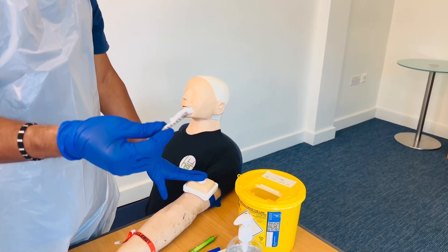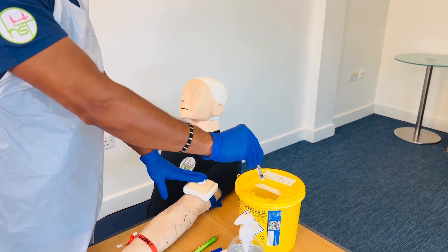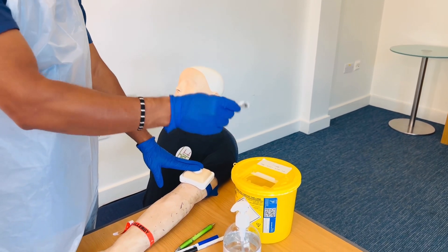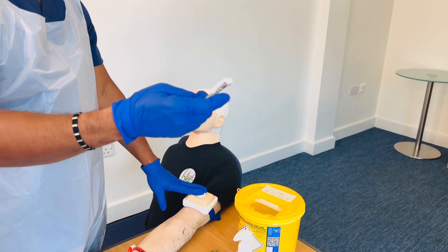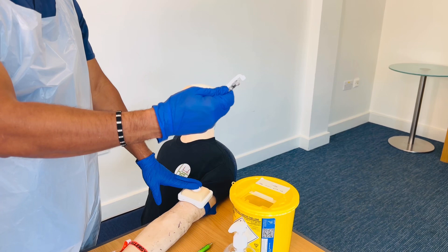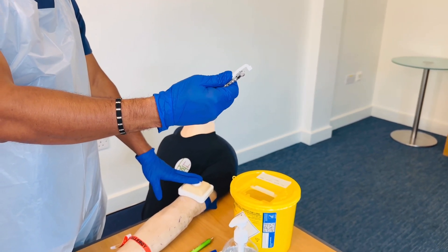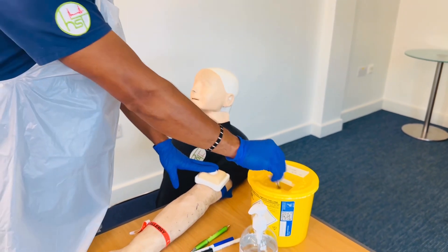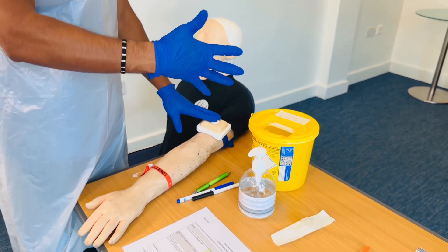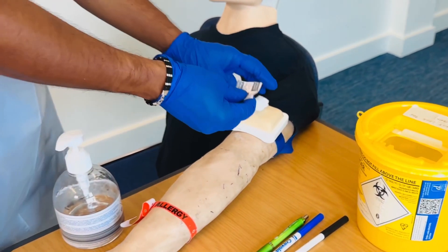What do you do with the syringe? The easy method is to throw it directly into the sharp bin without locking the safety cap. If you do want to lock it, push the white part with your thumb all the way until it locks, then discard into the sharp bin. You can then apply a plaster or offer the patient one.